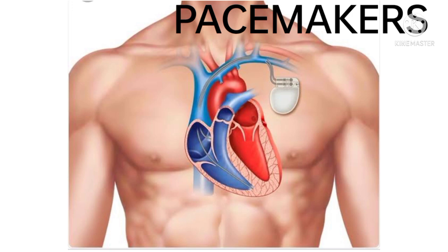2. Temporary pacemaker. It is one that has the power source outside the body. The pulse generator is external and the pacing electrode is inserted by transvenous, transthoracic, transoesophageal, or transcutaneous route, either at the bedside or under fluoroscopy. Types of temporary pacemakers. There are 3 types. 1. Transvenous invasive pacemaker, endocardial. It is preferred in emergency situations. It requires a hard-tipped or balloon-tipped pacing lead to guide into the right heart and into contact with the endocardium. It consists of lead or leads that are threaded transvenously to the right atrium and or right ventricle and attached to the external power source.